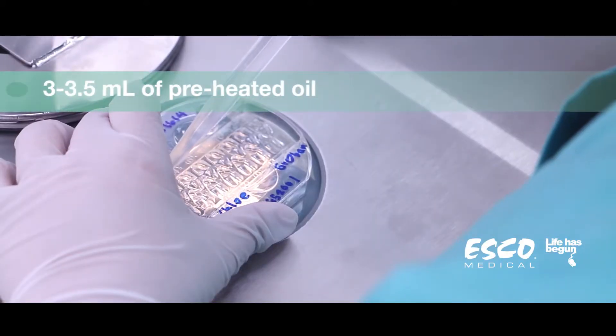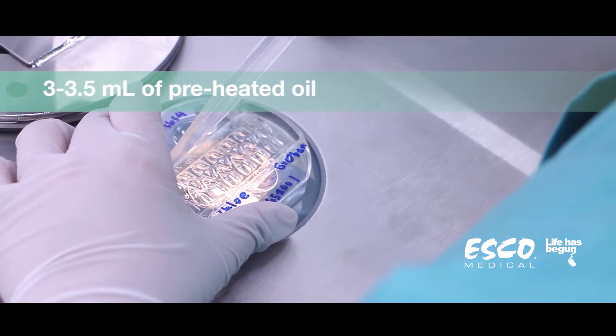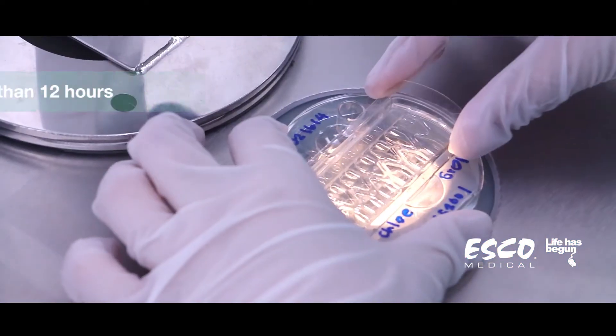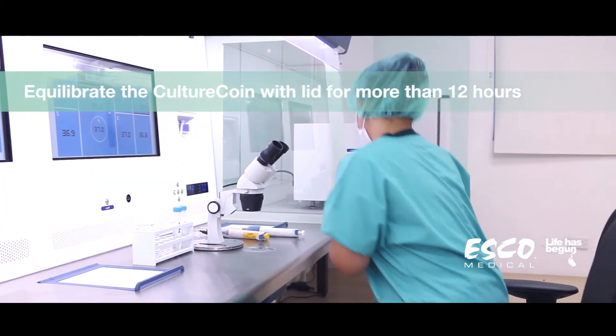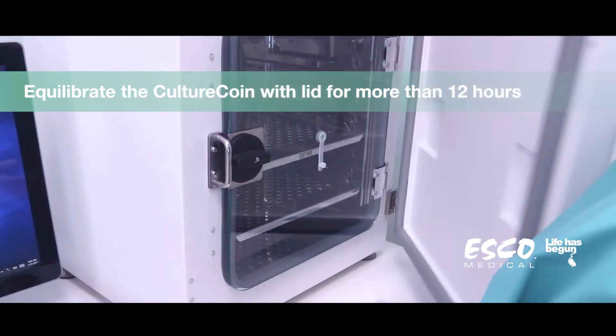Then cover the media with 3 to 3.5 ml of preheated oil. Put the culture coin with the lid inside an incubator and leave it for more than 12 hours for equilibration.